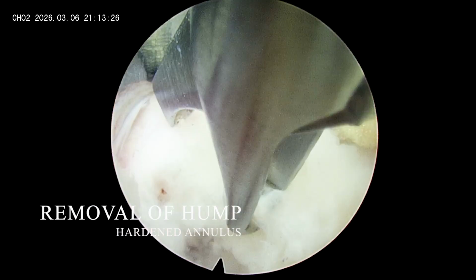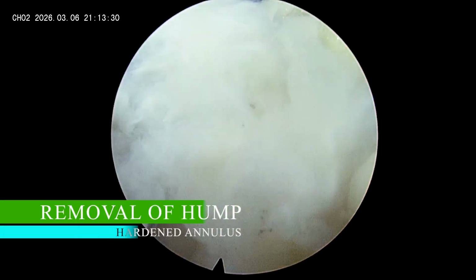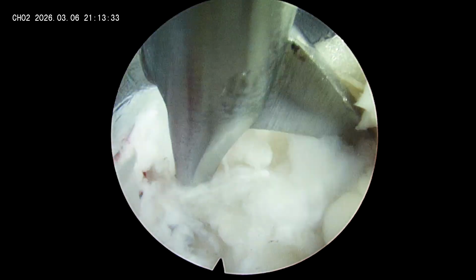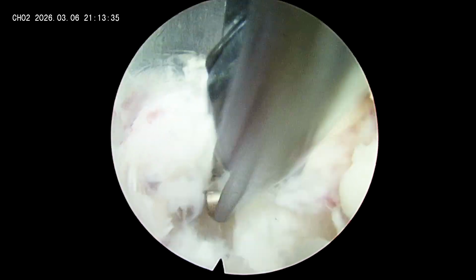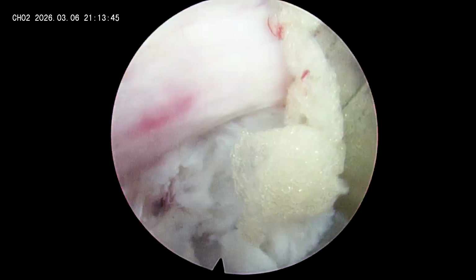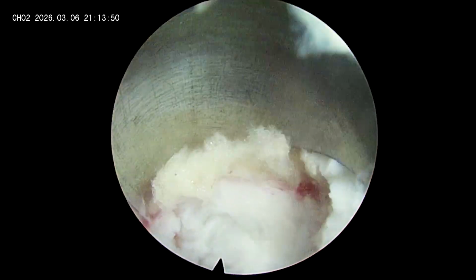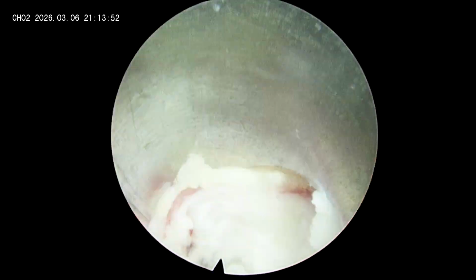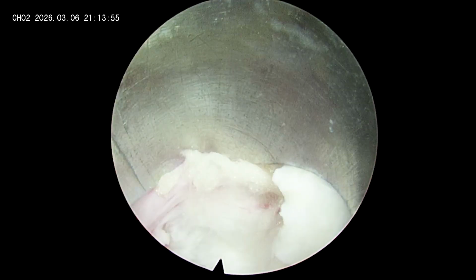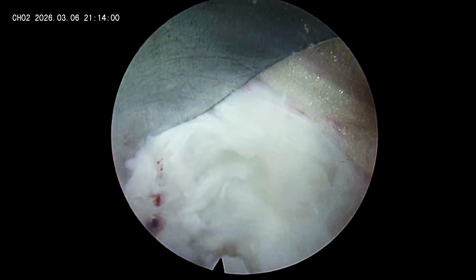So here I am addressing the hardened annulus near the superior end plate. You can see here I am using the cutter to remove this hardened annulus. It's very important to remove this part of the annulus because sometimes it can irritate the traversing nerve root. Even after surgery, the patient will have complaints of persistent leg pain, or sometimes recurrence of pain. So carefully address this sort of hard hump.